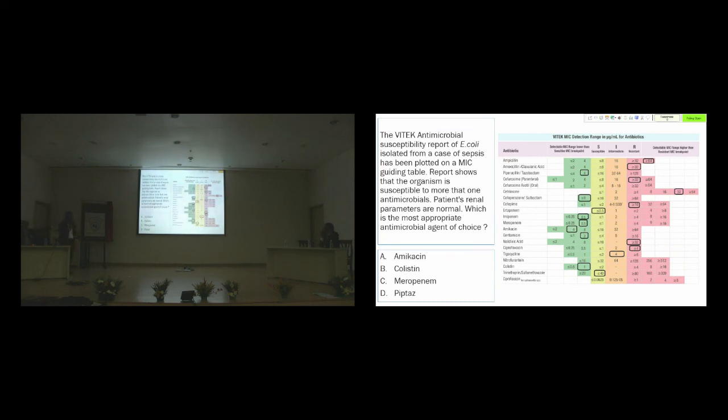Okay, this is one MCQ for you. How many of you are familiar with this MIC guiding table? How many of you use this for clinical reporting? Excellent. Sumit, do you use it? So this is a Vitek MIC guiding table, what bioMérieux gives. You answer this, then we will discuss how to interpret. Not working? Can't see? Okay, I will help you out. Wait.